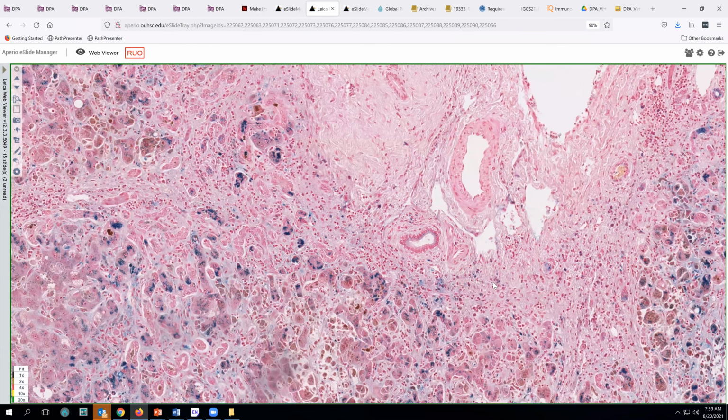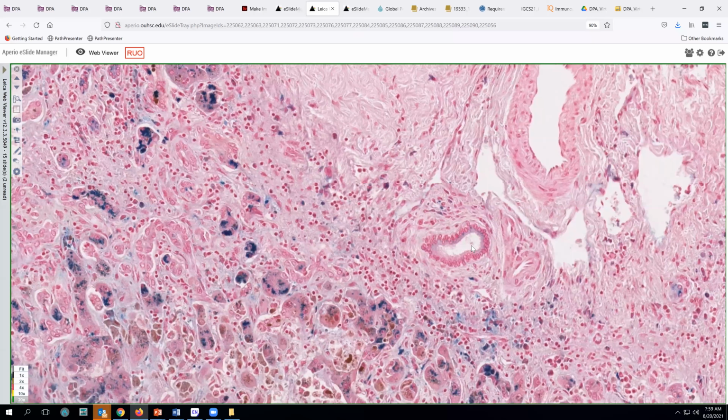But one thing that is very helpful is if you see iron in the biliary epithelium, that is almost the sine qua non marker that says this is hemochromatosis, because transfusion or other sources of iron accumulation do not result in iron being present in the biliary epithelium.